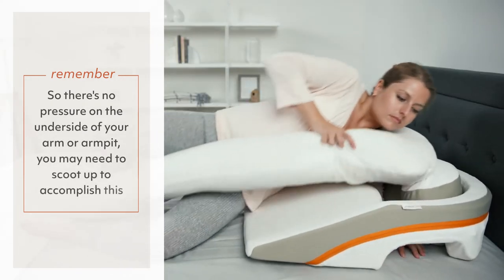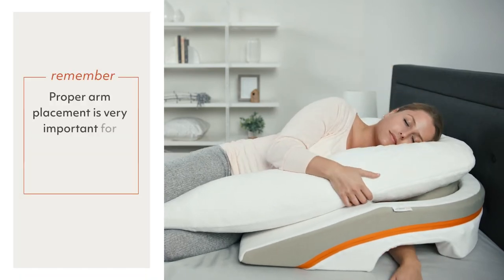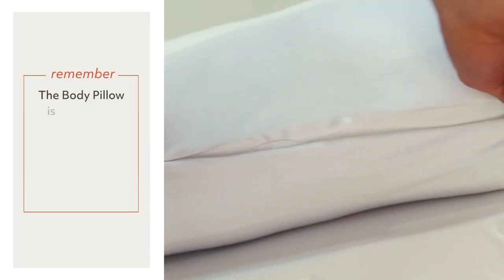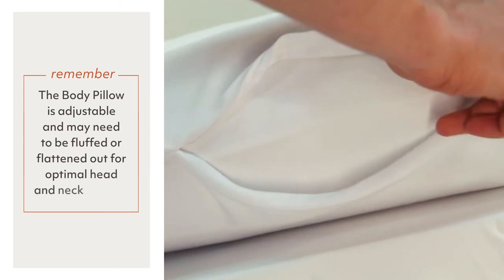Ensure that your arm is straight down so there's no pressure on the underside of your arm or armpit. You may need to scoot up to accomplish this. Proper arm placement is very important for comfort and it prevents sliding down. The body pillow is adjustable and may need to be fluffed or flattened out for optimal head and neck support.